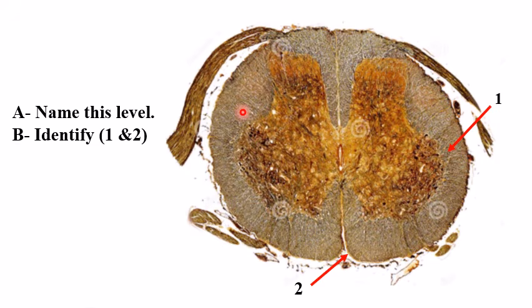Now, dear students, what is this? It is spinal cord. Why? Due to the presence of the H-shaped gray matter. What level? The lumbar. Why? The posterior horn is thick and parallel, as well as the anterior horn, the central canal is more anterior, and the white matter decreases a lot.